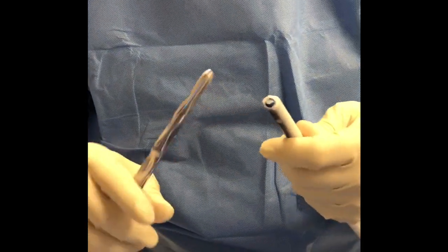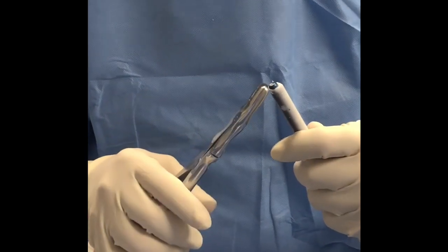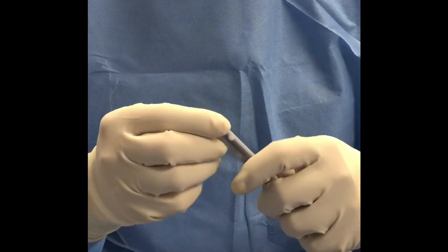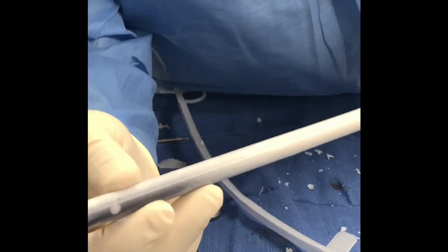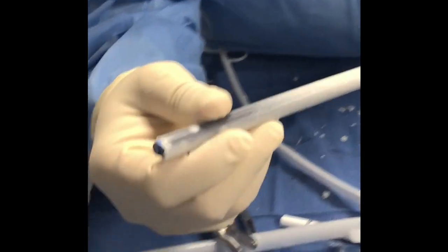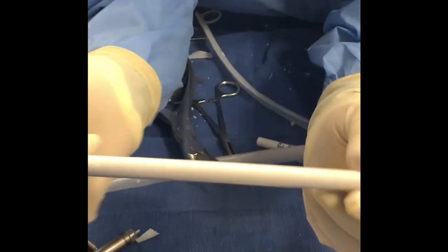I think the outer diameter is 11, and that's it — just a little trimming. You see the end of it? It's full of cement — kind of uneven, but that really doesn't make any difference. The nail is pretty smooth, and you can see the chunks of antibiotics in it.